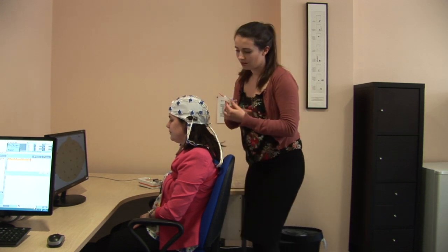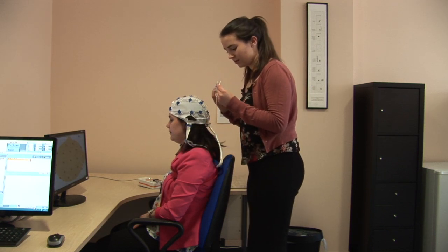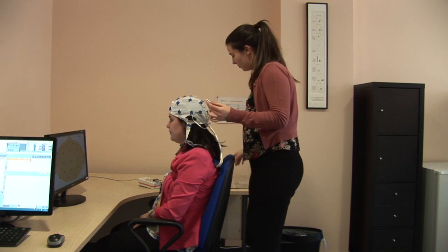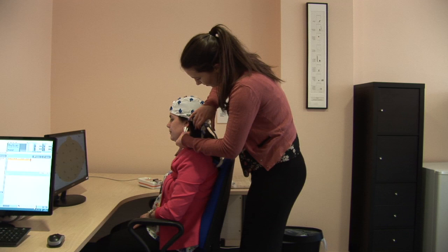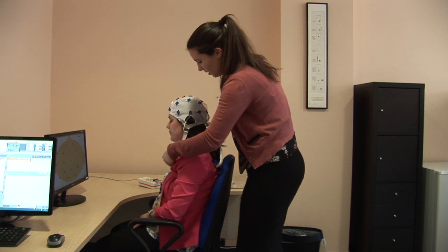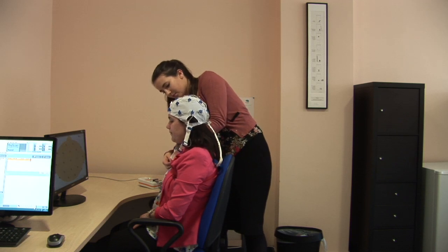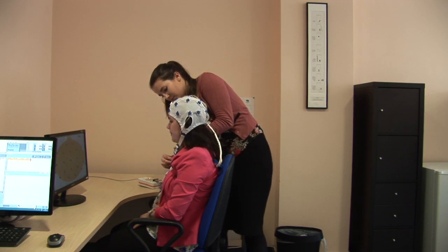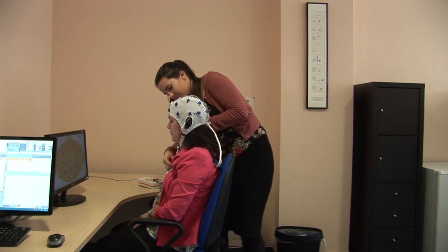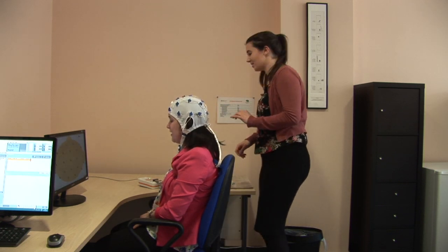Perfect. And again on the other side. Yeah, that's lovely. Now I'm just going to attach the cap down onto the belt. Do I look good? You look fantastic. Thanks.